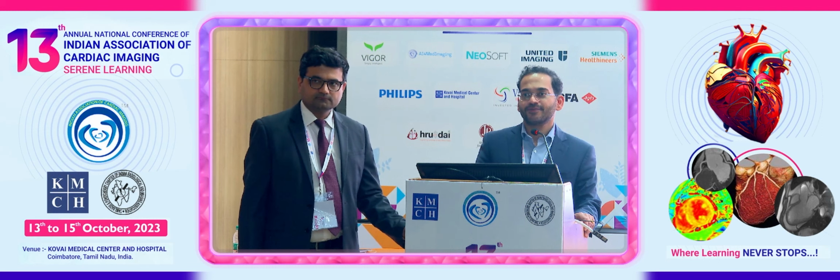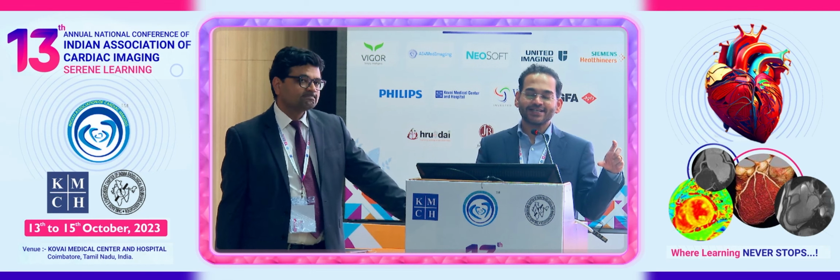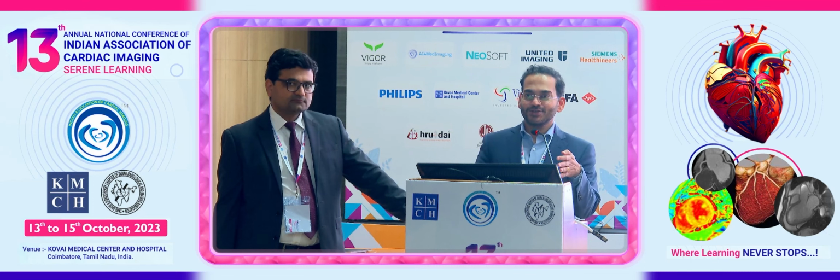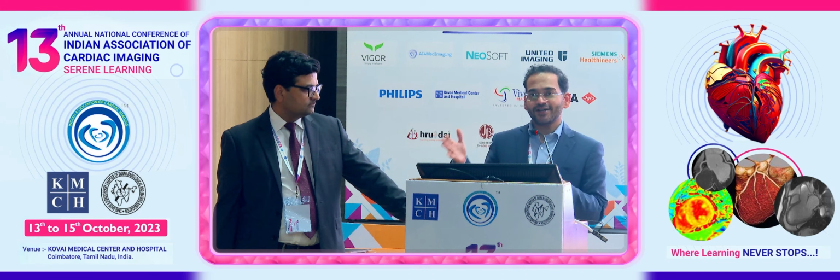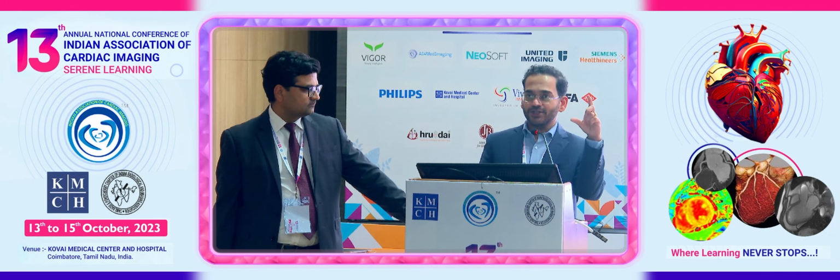That's a great question. The CAD-RADS 2.0 guideline says that you need at least 2 high-risk plaque features to use the term HRP. So what do you do if you only find one? You cannot use HRP if you just find one. But if I see only one particular feature, like a napkin ring sign, I would put it in my impression and say, although this does not meet the criteria to be labeled as HRP, there is presence of napkin ring sign. You'll find that not only in the body but also in the impression field.